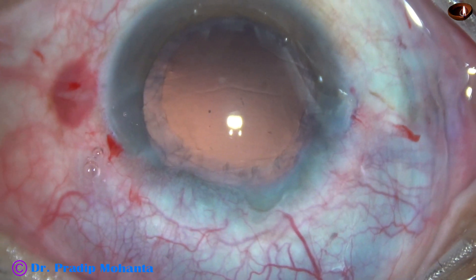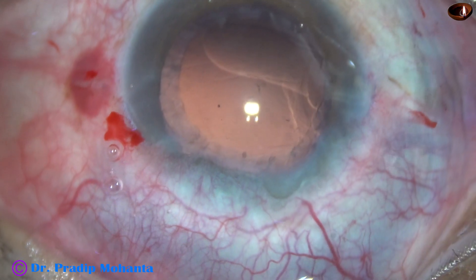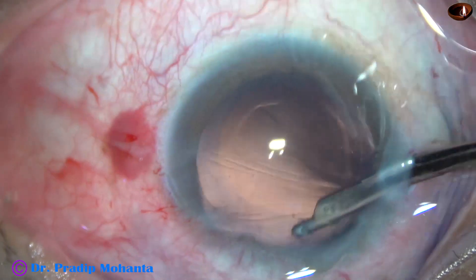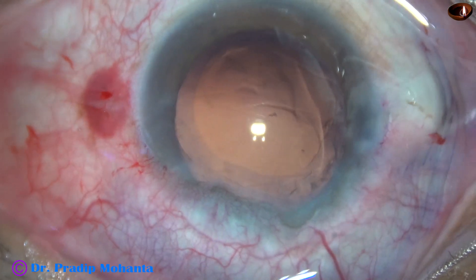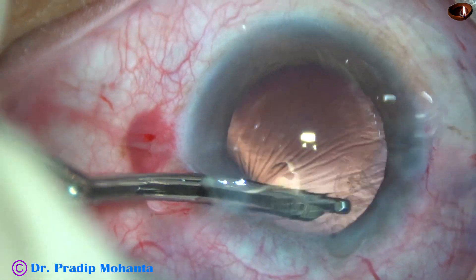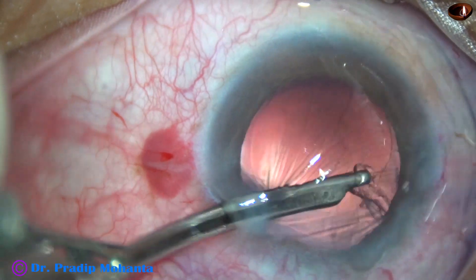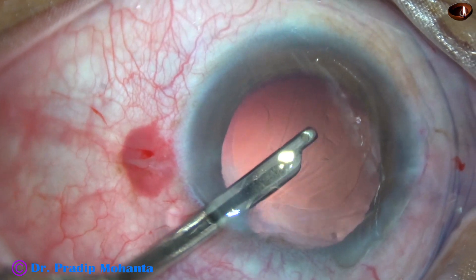Now I am going to remove the cortex. I am going to use both right and left hands. Using the right side port and my right hand to aspirate the cortex from the left side — from 12 o'clock to 6 o'clock. Now I go through the main incision, hold the Simcoe cannula with my left hand, and the 10 cc syringe to aspirate is in my right hand. I could aspirate the cortex easily.